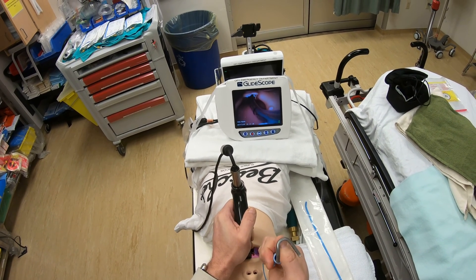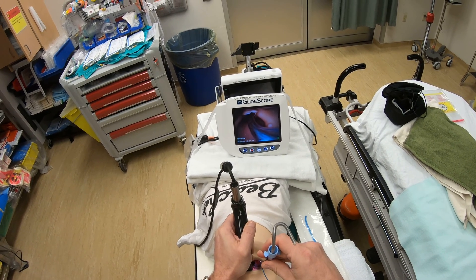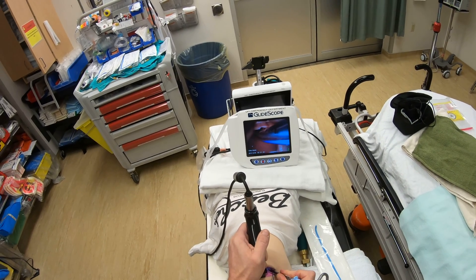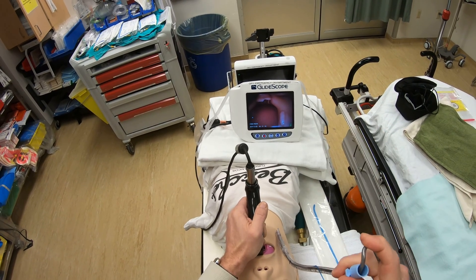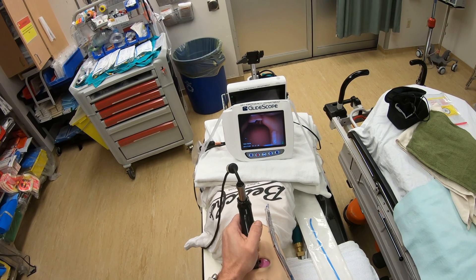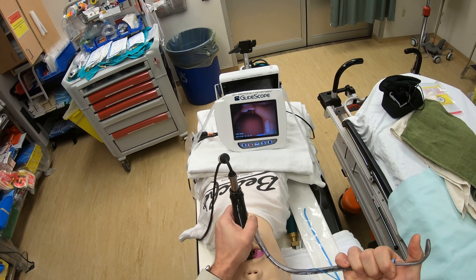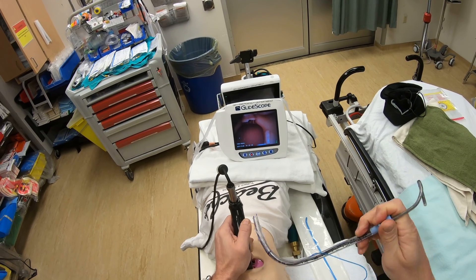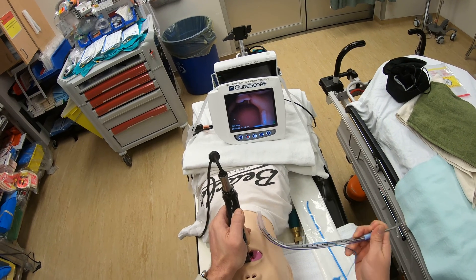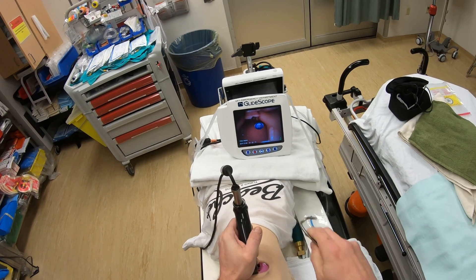At this point, do a pullback of three centimeters — don't do this for the first time on a patient; have somebody else pull it out three centimeters — but you can do that thumb flick. It works. Then drop or rotate counterclockwise as you push it down. Normally, once you're through the cords, you'd still hit the anterior tracheal wall. Pulling back makes the end of the endotracheal tube soft and flexible, and then rotating positions the entire distal portion in the same trajectory as the trachea, with the bevel open face up.